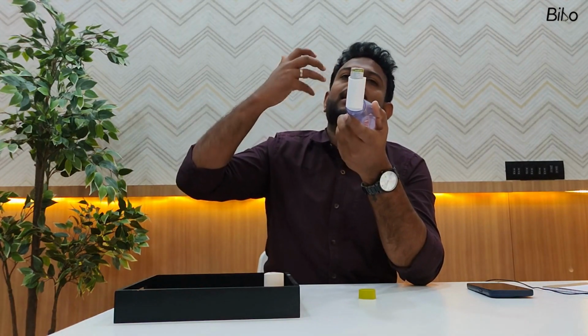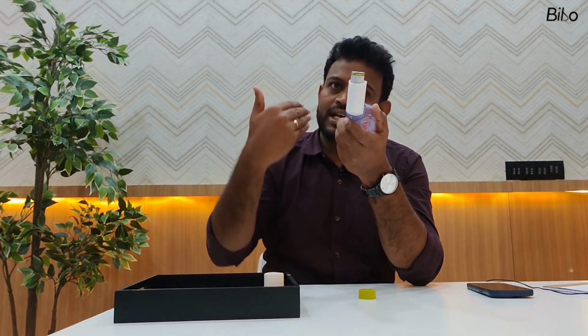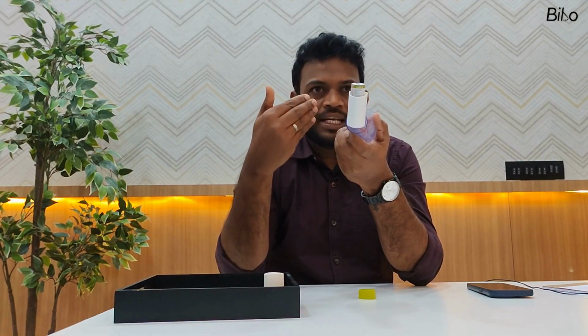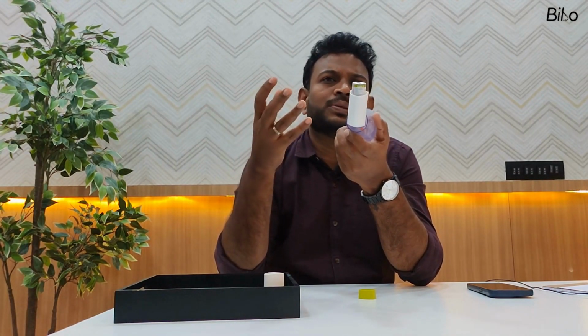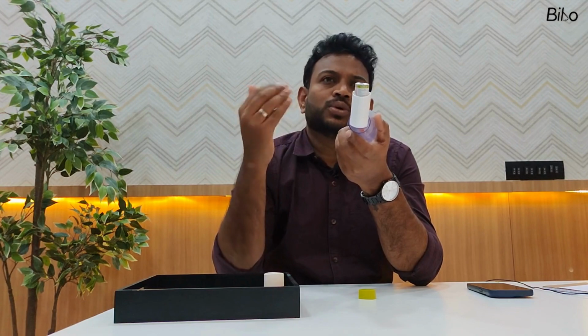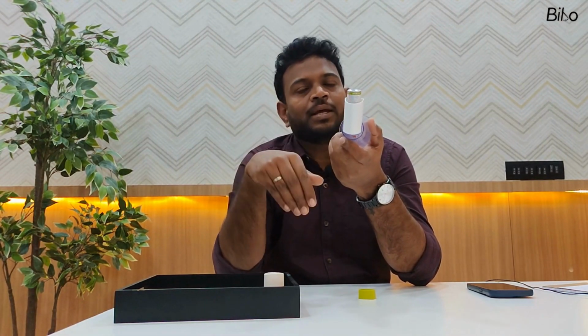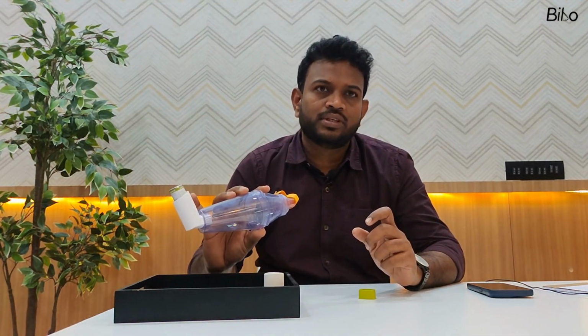So again, inhale, hold, exhale. This is the second. Similarly, inhale, hold and exhale. This is the third time. So we continue till we finish however many repetitions have been advised by the doctor. Few advise 4, few advise 5, few advise only 2, depending on the patient's condition. So usually 4 to 5 is ideal. Once you finish all the 4 to 5 repetitions, only then remove the device from your mouth. Then the next step comes: we have to rinse our mouth immediately after taking the inhaler.